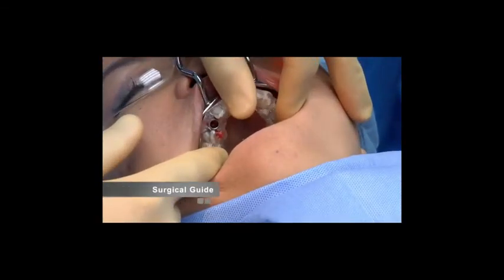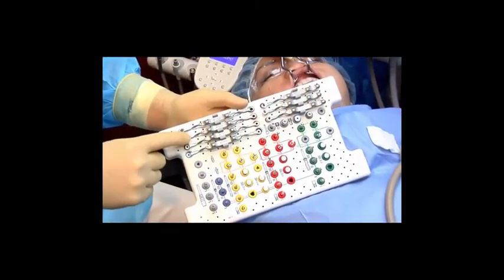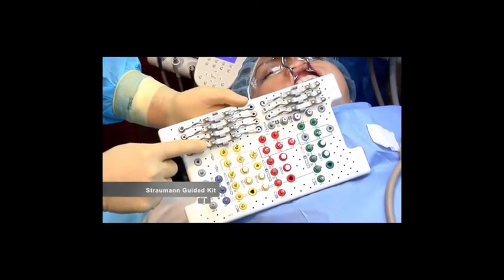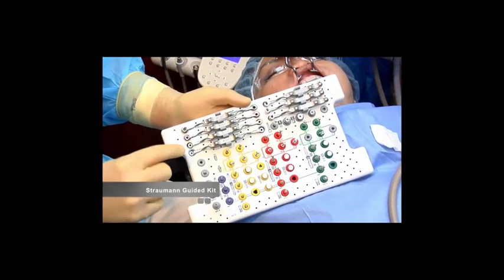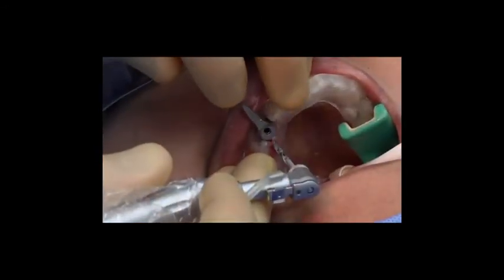Here's the OptiGuide in this case that was fabricated by CCAT. It's placed, it fits very well. And this case was obviously planned for Straumann guided surgery. So here's the Straumann guided surgery kit with the different handles and keys and the different drills. Pretty straightforward kit. For those of you who are not Straumann users, this is very straightforward. For those of you who are, you know how this works. Other surgical kits are similar.